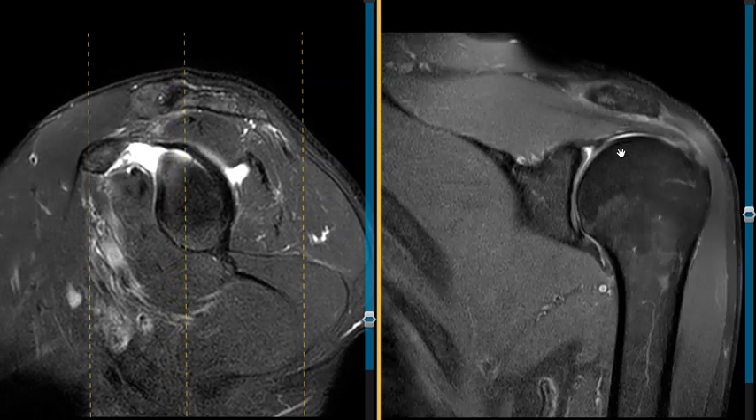This is a coronal view, looking straight at the shoulder. We see the humeral head, neck, and shaft here to get oriented. This is a cup called the glenoid, which is part of this big bone, the scapula. It forms a cup here, and around the rim of the cup we should see a little black triangle called the labrum.